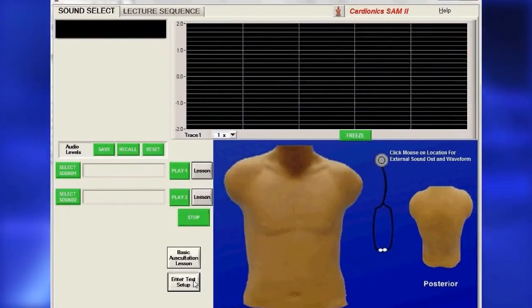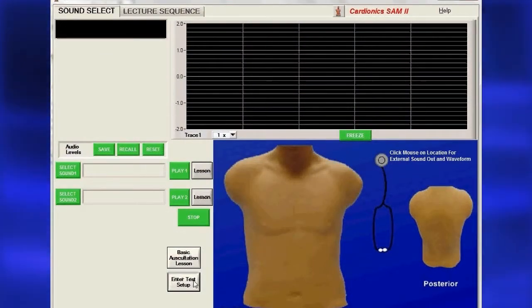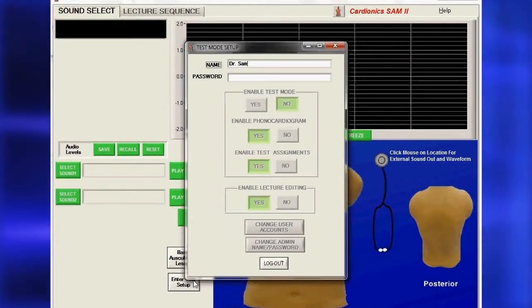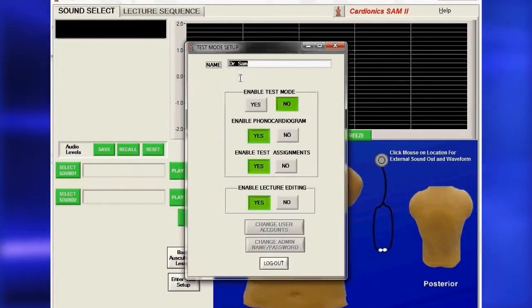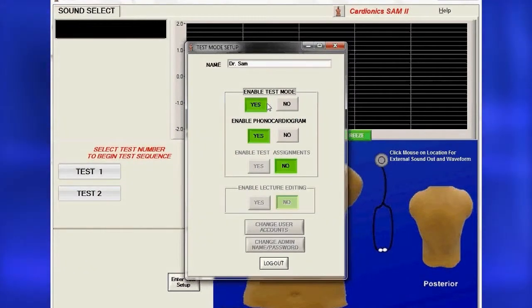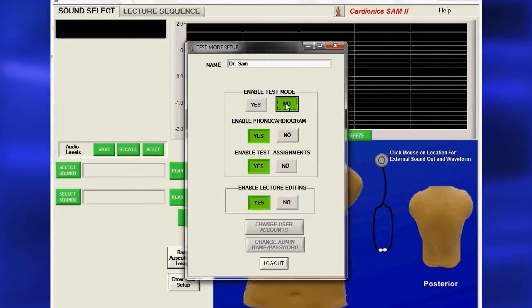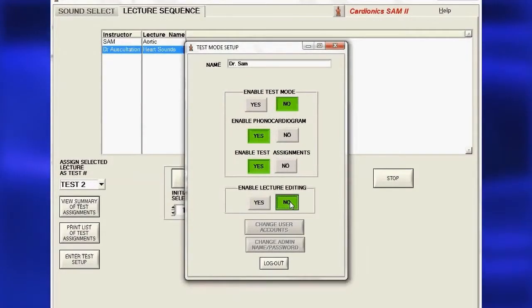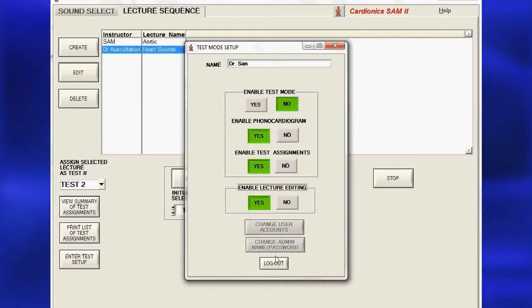On either the Sound Select page or the Lecture Sequence page, click Enter Test Setup. Enter your name, then click Enable Test Mode. To prevent your lecture from being edited, click No in the dialog box of the Test Mode Setup. To edit your lecture later, simply open the dialog box again and click Yes.